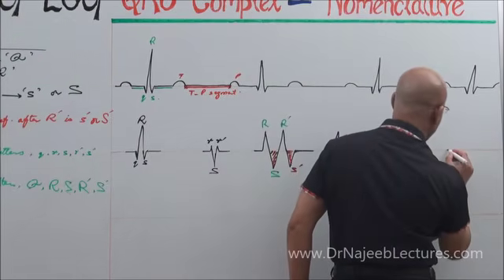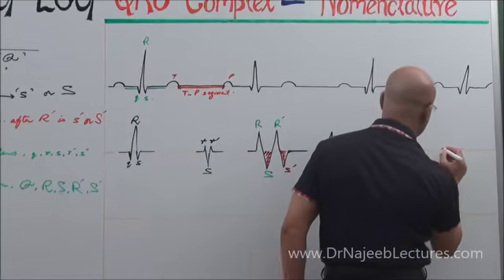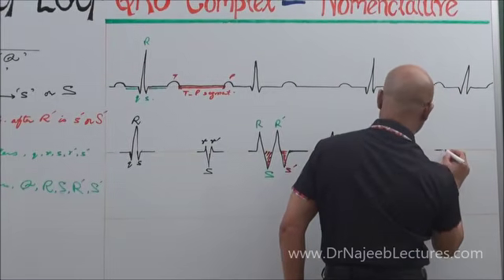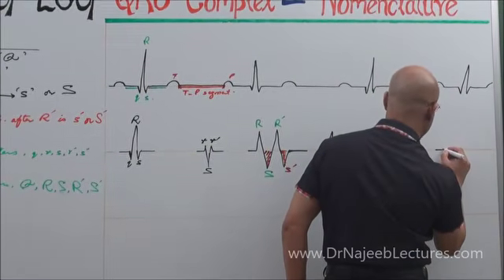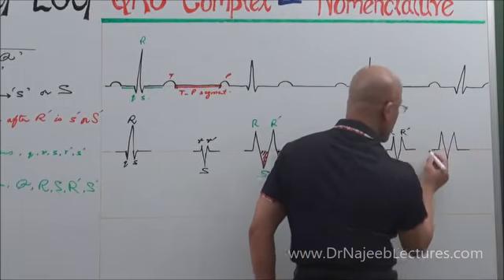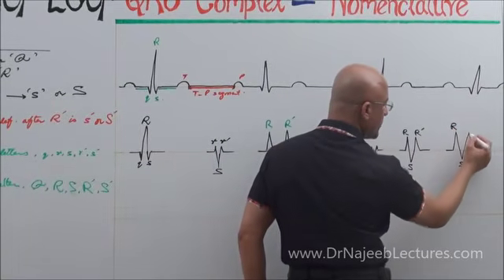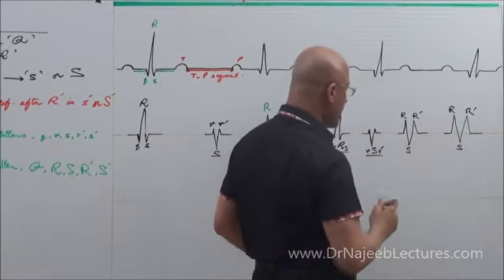Then I'm going to make one more, just for practice. If you find difficulty in labeling, please tell me. What is this? R, S, R prime.